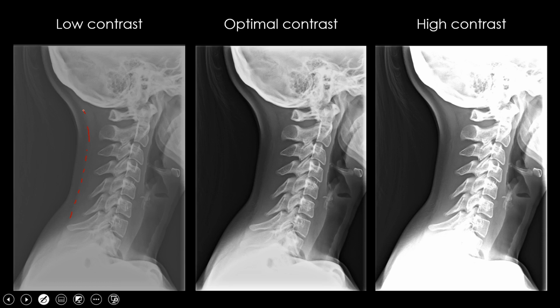As you can see on the optimal contrast, we can see very good delineation between fat and water.